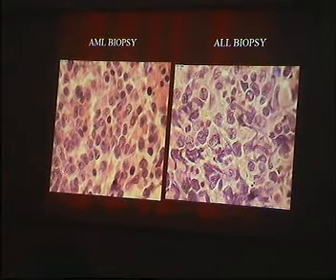This was the AML biopsy of that same patient, the previous one, and look at the ALL biopsy which I had shown you. It's sometimes very hard to differentiate between the two. You can do an IHC, but if I don't give a clinical history, it's sometimes hard. Of course, there are brilliant histopathologists who will give me an answer, there's no doubt. There are people who just put the slide on the microscope and say ALL, AML. But in this case, you will need immunohistochemistry to differentiate between the two. Next slide.